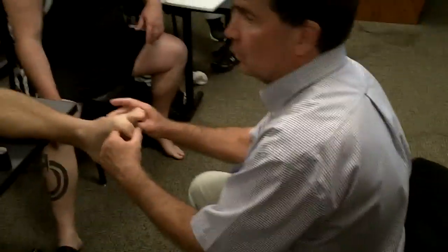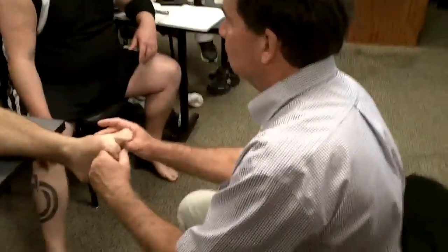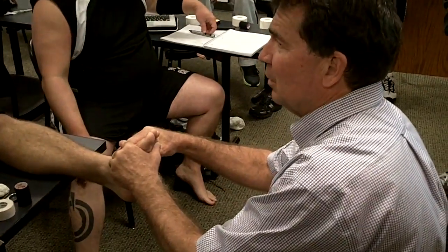You join in, you go into hyperflexion, and we have pain. So the first thing we're going to do is move him into a neutral position — I just move him up. He's got to stay there.